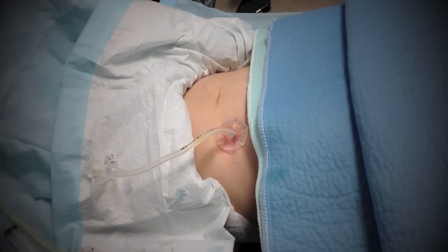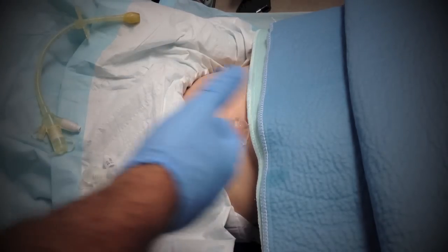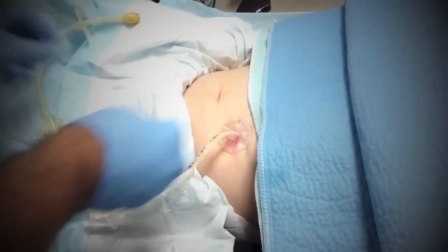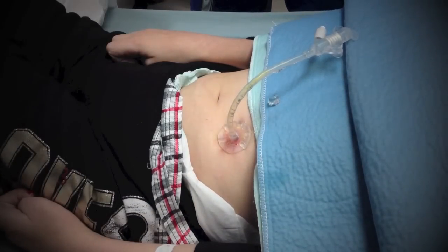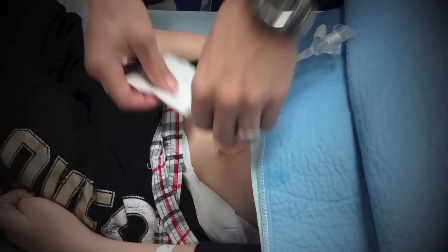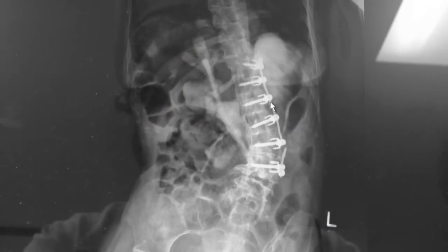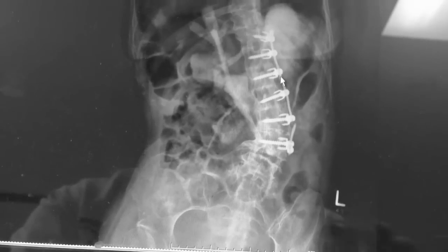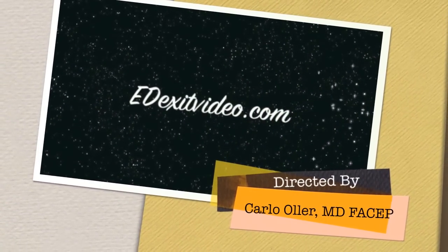And that's it — the tube is replaced now. There's no special gauze or anything like that; we just put something to absorb whatever is around it. Whatever normal care you used to do, that's still the same. I hope you enjoyed this video and learned how to replace the G-tube and how to confirm placement.